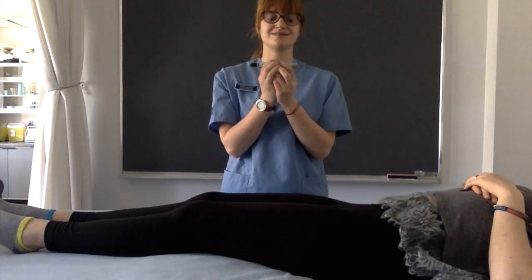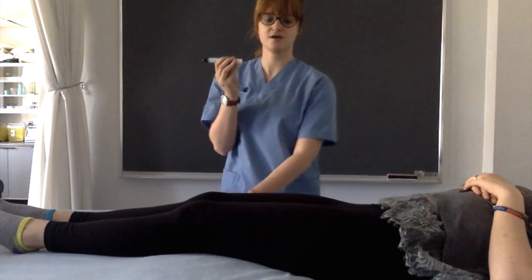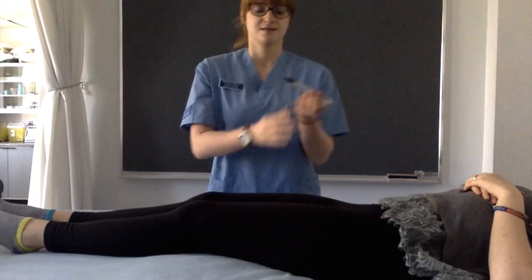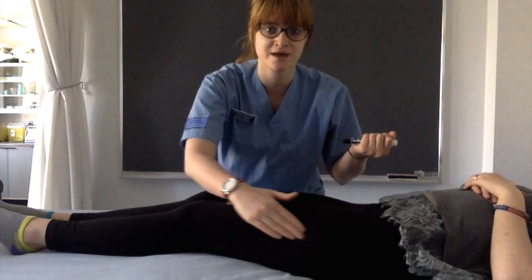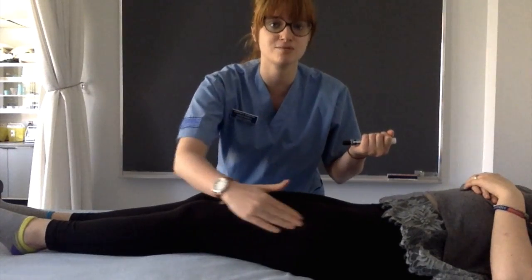As I showed you previously, we're going to remove the safety lock, take the outermost part of the thigh right here, and push in until you hear a clicking noise. Then massage the area for 10 seconds and call emergency services.